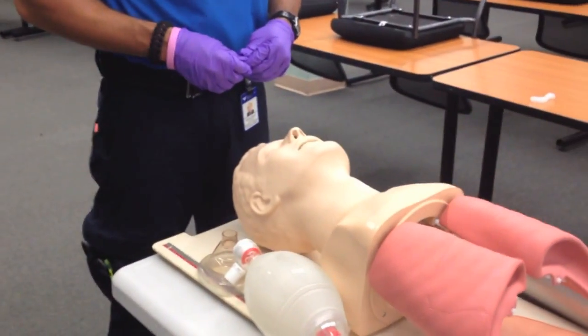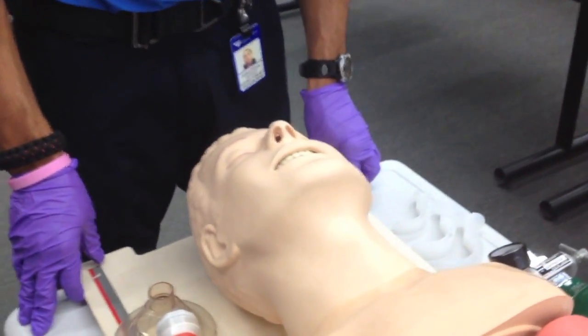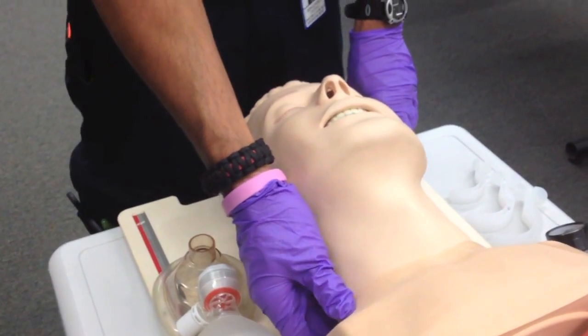When I look at the patient, does he look at me? He does not. I'm going to say, "Sir, are you okay?" — no response. I'm going to pinch the patient's trap for painful stimuli. Does he respond? The patient is unresponsive.